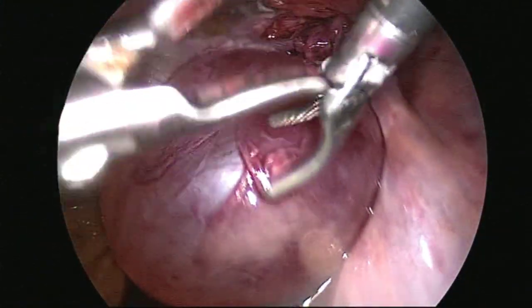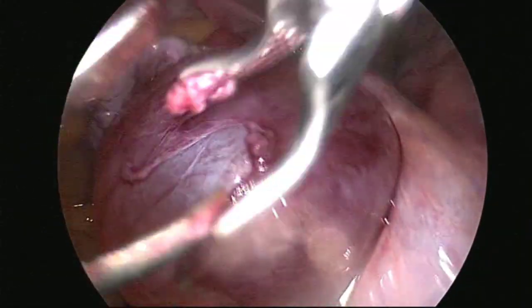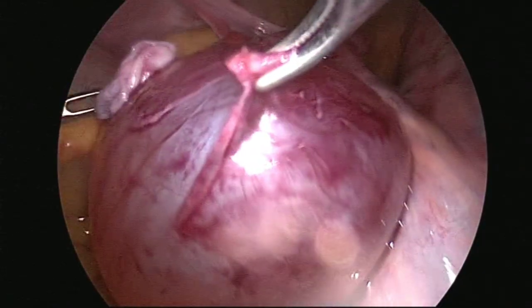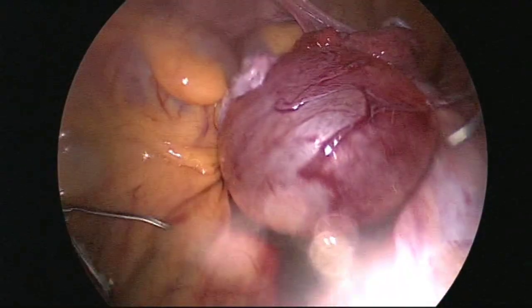Okay, now we'll aspirate this cyst at the end.